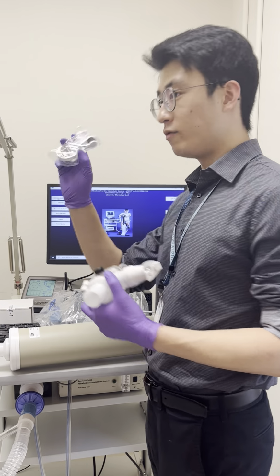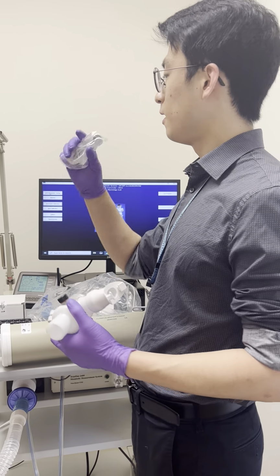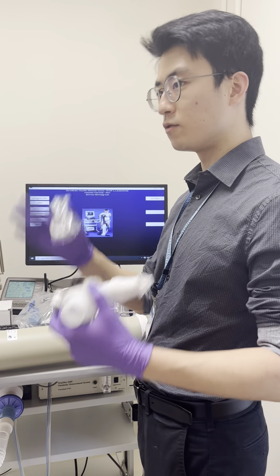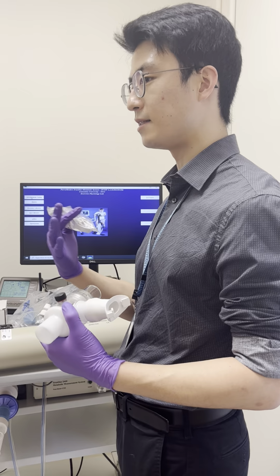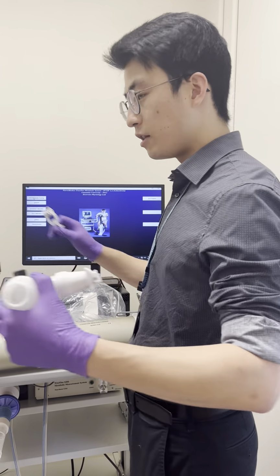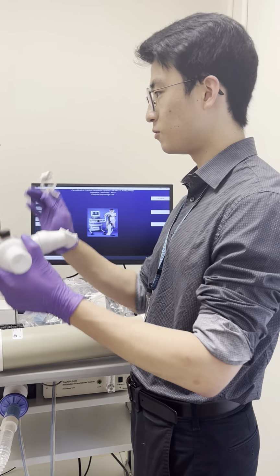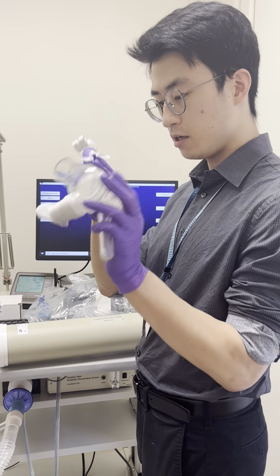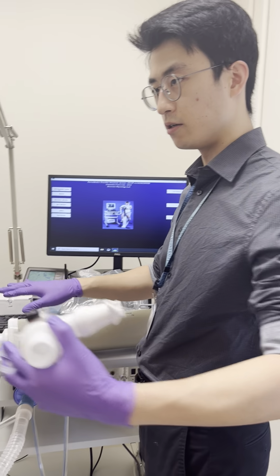And you want to have a backup on hand, because if during a test the patient loses their nose clip, the next one should go on immediately, right? If you go for a period of time without the nose clip, then that data is going to be useless. All right, so those are all the things you need to prepare. You need the valve, which needs to be cleaned, and I'm sure that the cleaning protocol is going to be discussed separately. You need a mouthpiece, a nose clip, and all the other stuff.